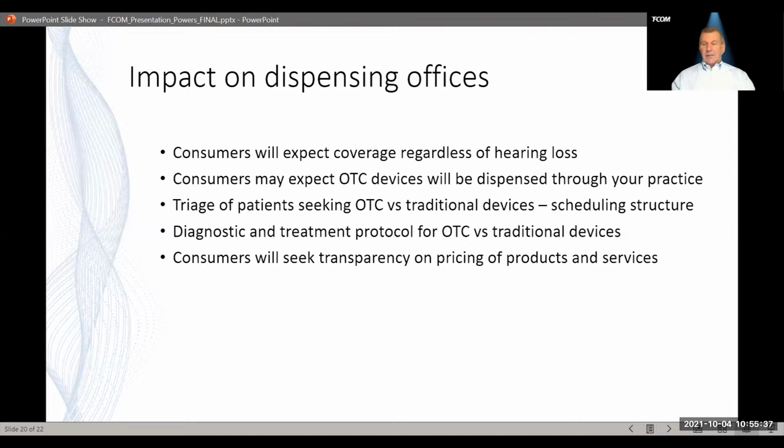Certainly the hearing loss is one of the first things, and we would encourage everybody to get a hearing test first to find out whether or not you have a mild hearing loss, moderate hearing loss. As we know, self-perceived hearing loss is usually milder than the actual hearing loss. Many people believe their hearing loss is not nearly as bad as it might be from having a hearing test. But we also need to find out how well they're doing in the environments where they feel they are having difficulty. Many early users, mild to moderate hearing loss, are situational wearers. They wear them potentially only when they are in background noise, in a meeting, in a restaurant, at family gatherings, etc., because they feel and probably might do okay in quiet environments.